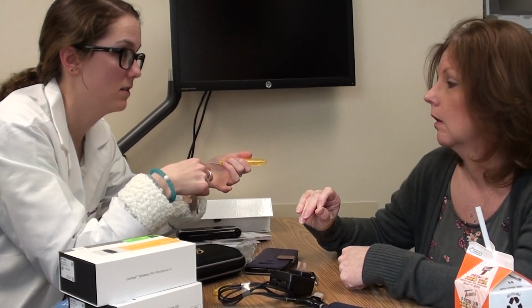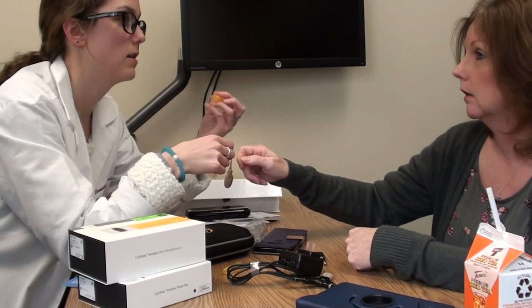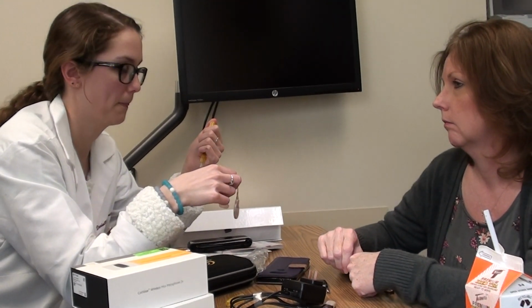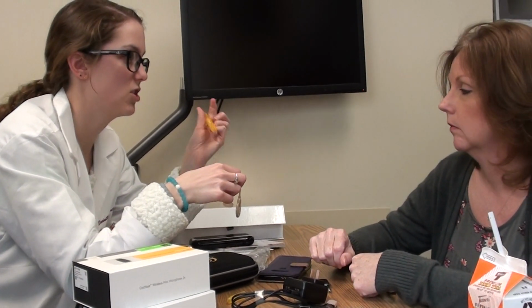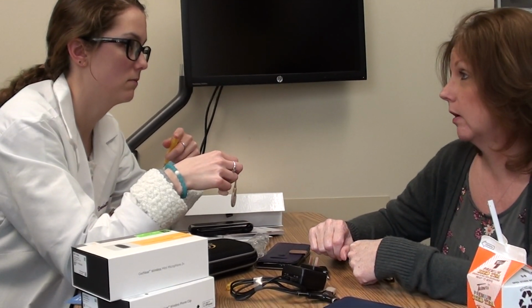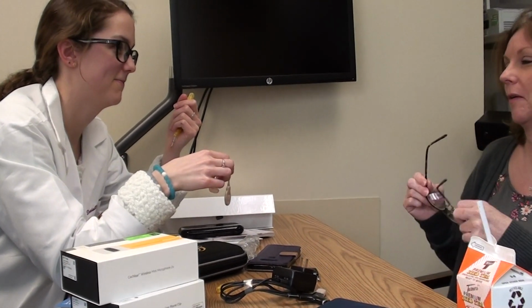This is just in case you accidentally bump it. Oh, okay. So you can unlock it? Then you unlock that. Oh, okay. But you should just keep it unlocked all of the time. It's for little kids so they don't take the battery off. This is just in case you accidentally lock it. Has that happened before? Not often, but it has.